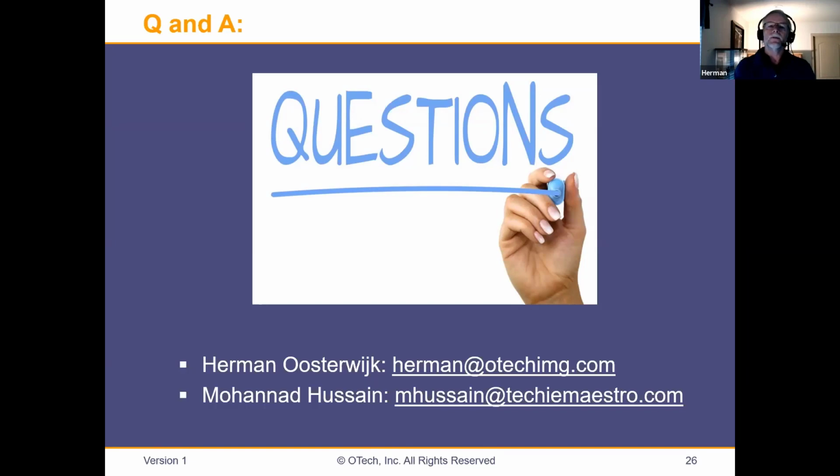So it will be on the periphery: anytime you make a connection to the outside world or use some kind of internet infrastructure, DICOMweb and FHIR will be advantageous because you use existing tools and existing infrastructure. That's where it will start, very slowly. Now, when will the CT scanner start talking DICOMweb to the PACS? I don't know, because why would you change something that works unless it gives a major benefit?